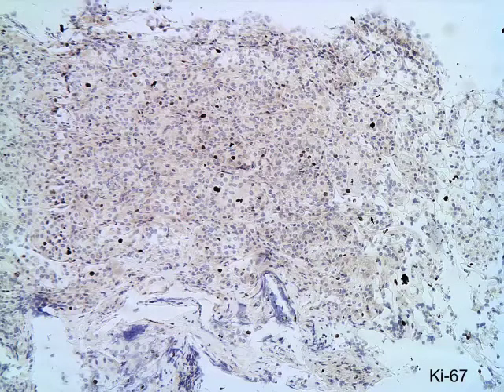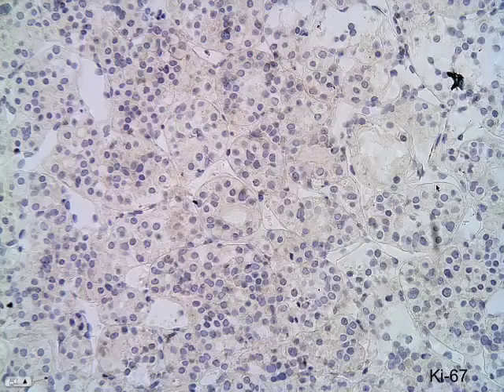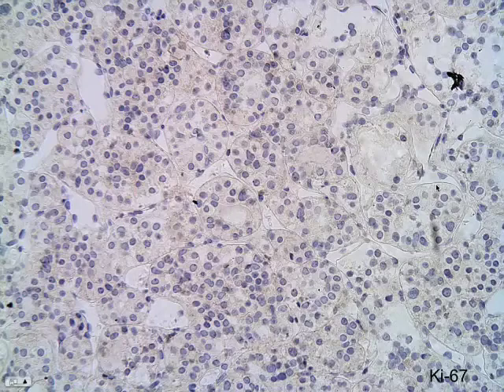There were fragments that were definitely adenoma. Here's also evidence that kind of proves that it's adenoma. If this was normal pituitary, it wouldn't be proliferating. And this is a Ki-67, and it shows activity that we called about 3 to 4%, which is probably the upper limit of what some of these fields are here. Definitely maybe 3 to 4%, but then as you can see, there's a little bit of architecture still left in here. This is the normal pituitary, and you can see the Ki-67 is completely dead, 0.